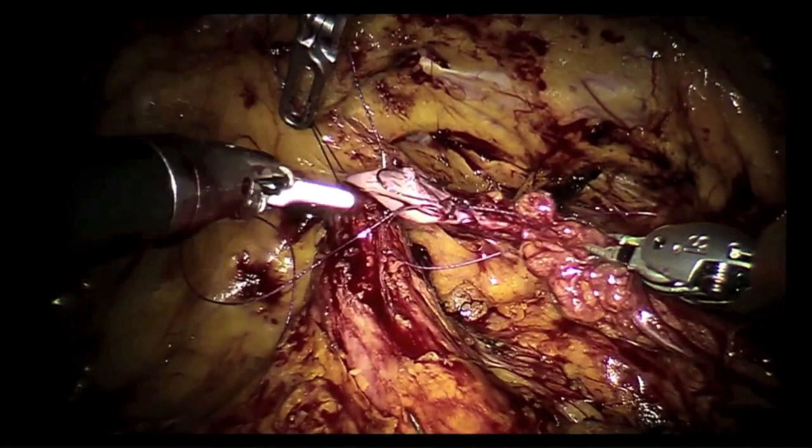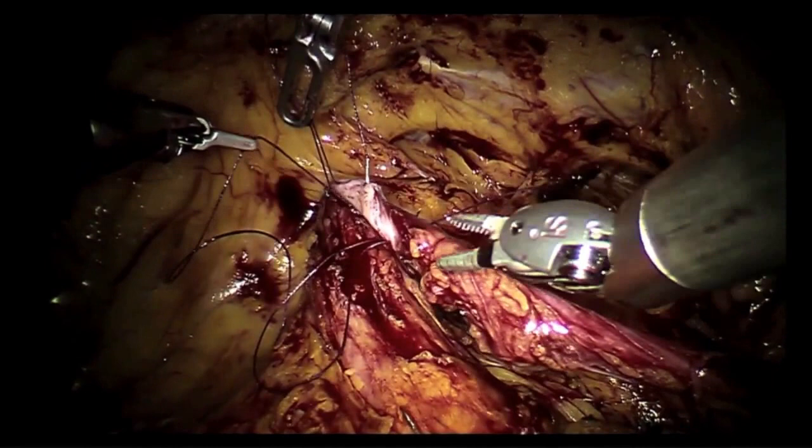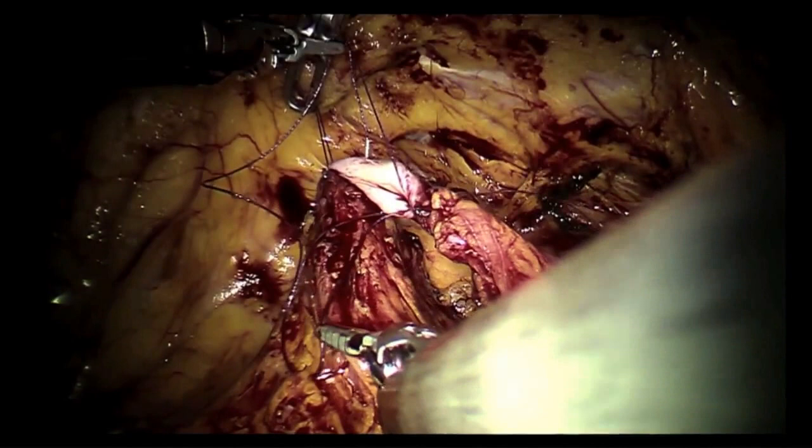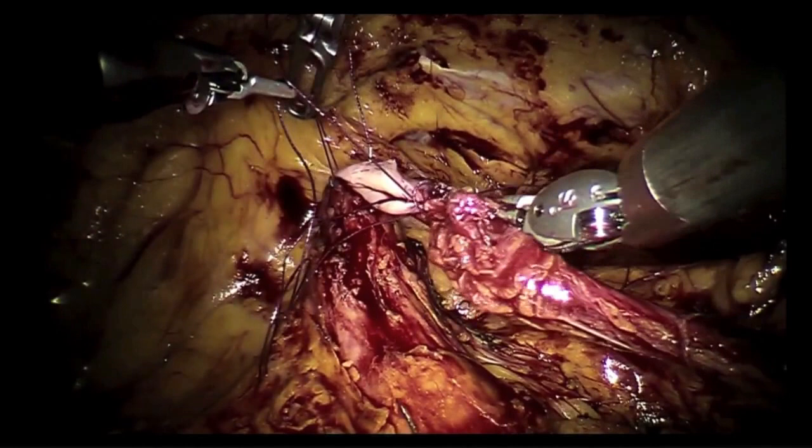Dr. Gill, all your robotic cases are living related, right? No cadaveric. No cadaveric yet. Are you planning to do? I think that would be ideal. I mean, you got a long vein, a long everything. That is ideal. The whole stress is lesser. That would be ideal.